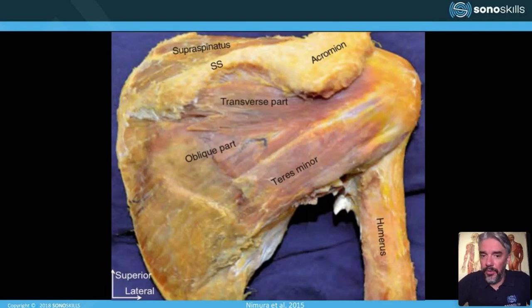And also, I would say, when scanning the tendon longitudinally, adopt an oblique position of the transducer, like that, and not too much like this, because this I see too much in courses. So this is more on top of the fiber alignment.